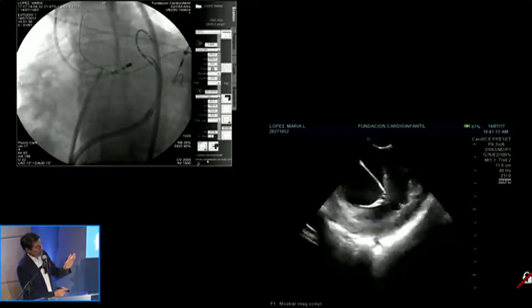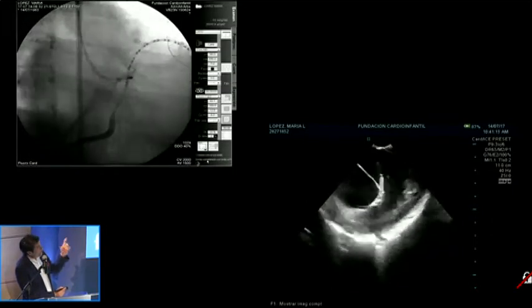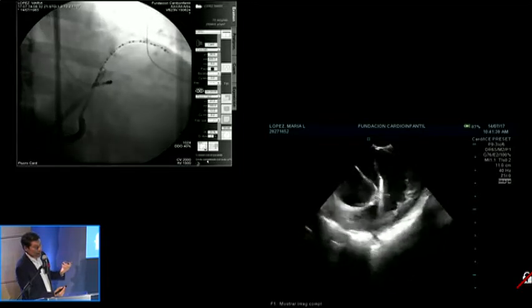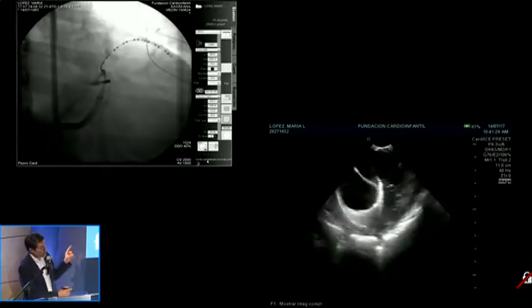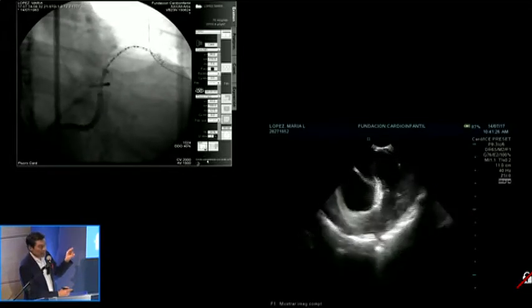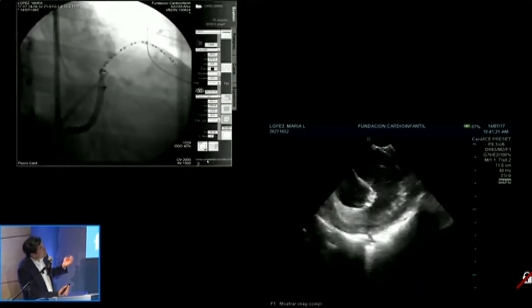At this point, we have considered three therapeutic possibilities. They have used different tools for diagnosis. They started with the analysis of the EKG, and that exercise will be done by Fermin based on the slides that he has prepared for you.